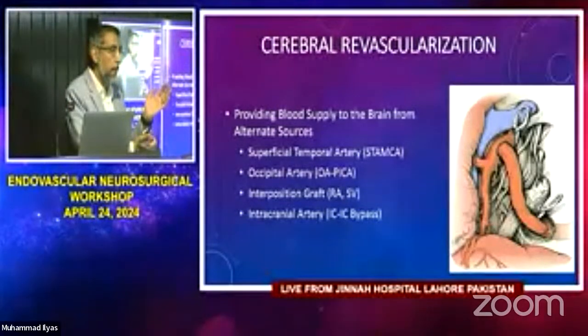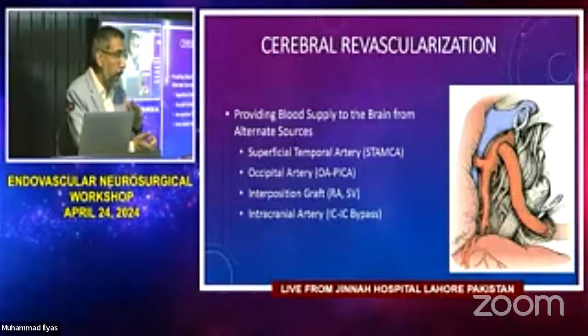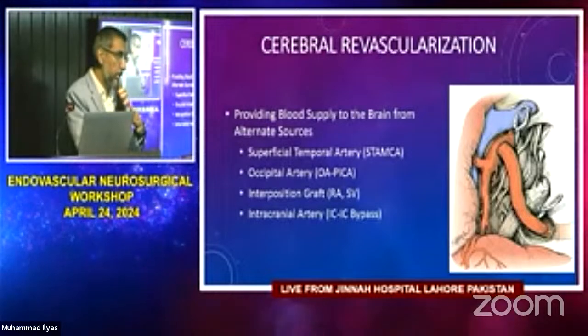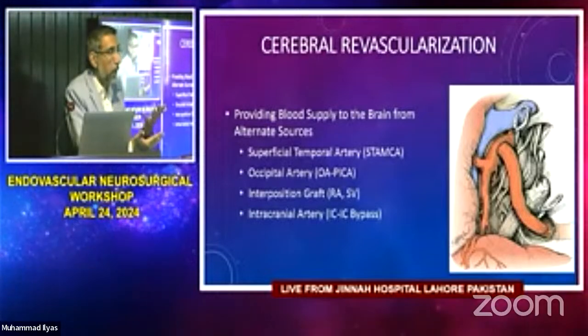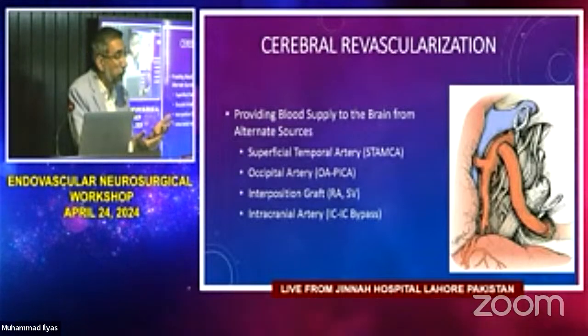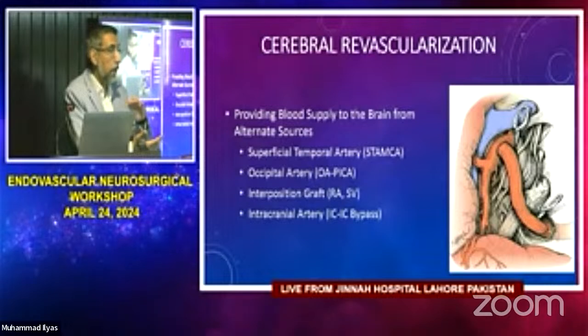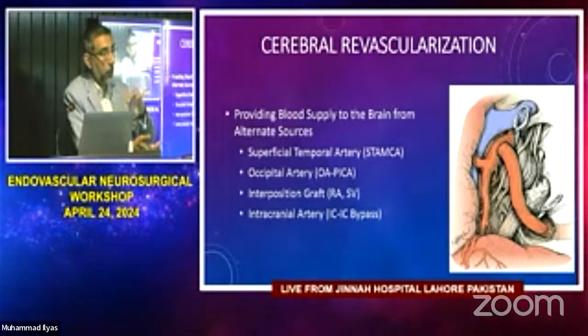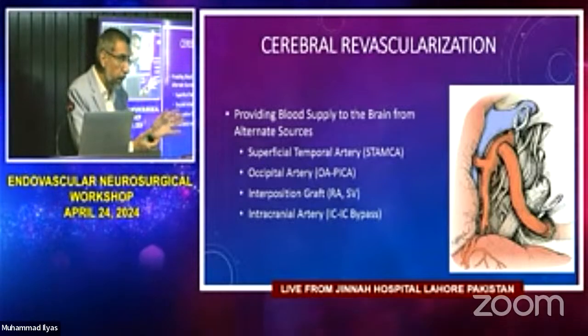So if you have to coil an aneurysm and pipeline it, you have to put the catheter behind your pipeline. You can coil it and then put your pipeline device. But still, it's 30%. That's why you can put pipelines across, let's say, the anterior choroidal artery, because it doesn't go down. The demand keeps it open. You can put it across the ophthalmic artery. The ophthalmic artery typically will not go down.